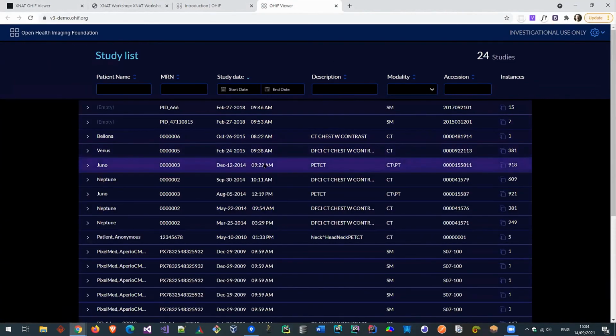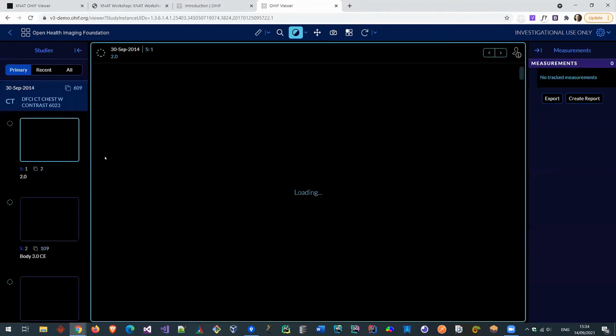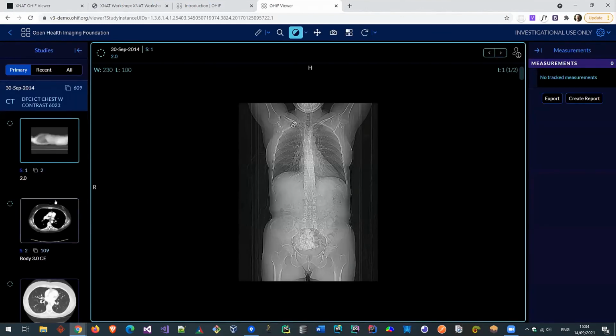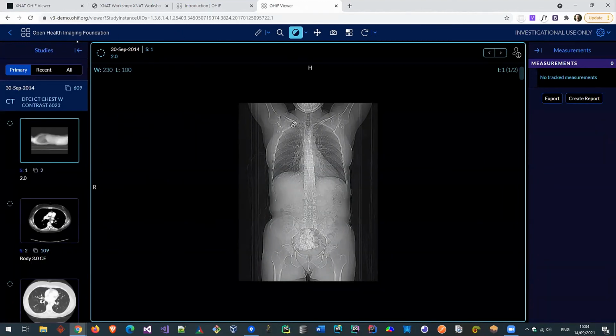Okay, just selecting. So the study list, we don't use the study list with the XNAT OHIF Viewer, but this comes with the vanilla OHIF Viewer. So on the left, you see the studies. They try to save, to create an extra row at the top by moving the panel, but they again added some info on the top of the image. So just lots of changes in the layout. I'm not sure if this will look friendly to the users, but this look and feel we can always change, so there's no problem about that.